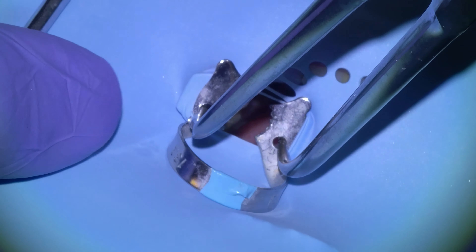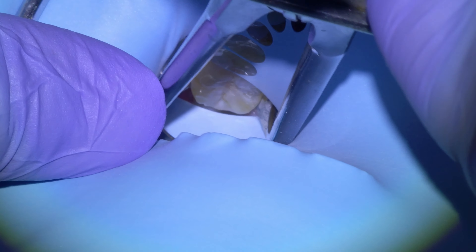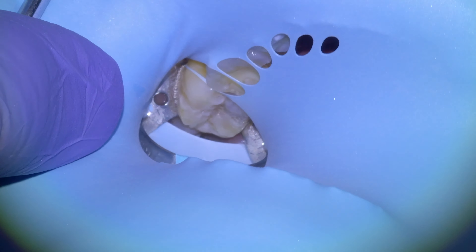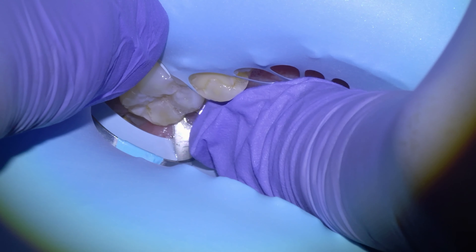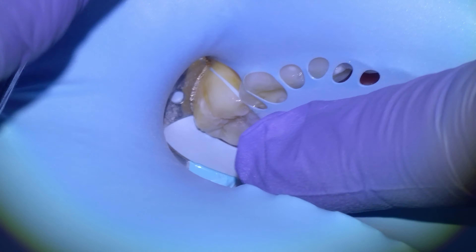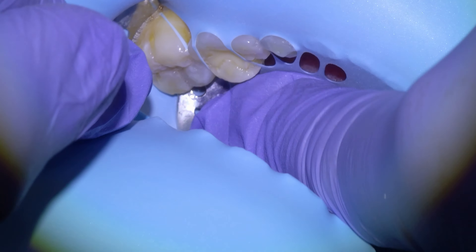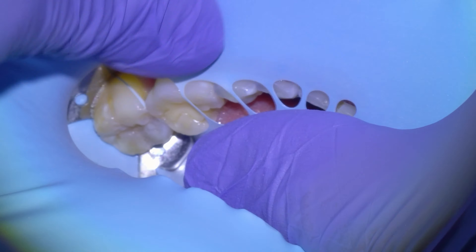Dr. Dobson here. In this video we're just going to be repairing a fractured molar — we did this one just this morning. This patient is actually a friend of mine and he was curious to see what the process looked like, so we recorded it. We're going to get started by isolating the quadrant of teeth with a rubber dam, putting it on from the second molar to the midline, and we would have given a cartridge of anesthetic into the mandibular nerve prior to getting going.